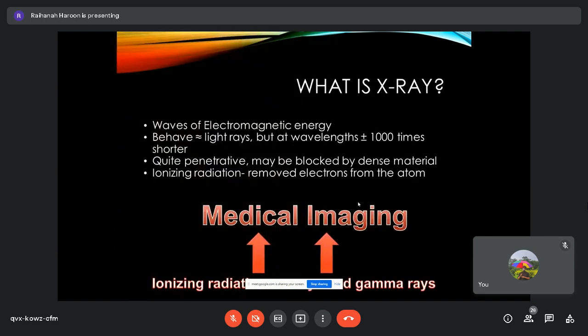X-ray basically is radiation, and you need to know the basics because I want you to know what you're dealing with. You are going to be the ones who order this, okay? So it's something that you cannot see. If X-ray were something you could see, like red color or green color, it would be easier, right?